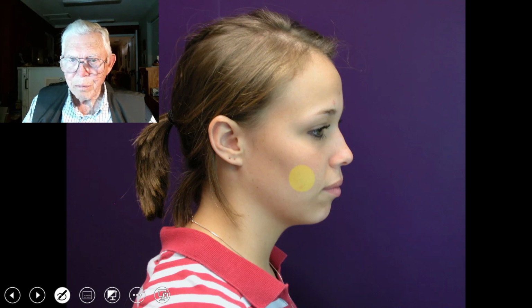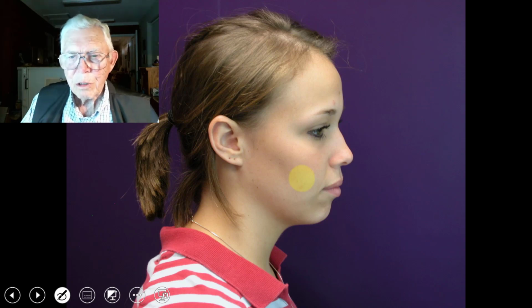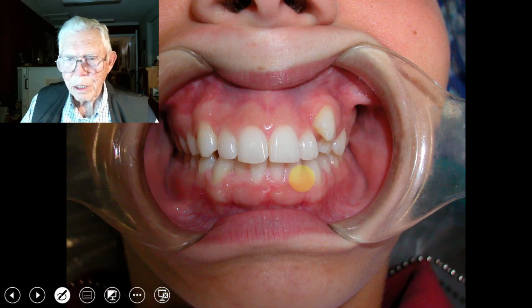And from the profile side shot here, the lips are out further than we would really like to treat a case, but I would never recommend taking out her bicuspids unless she actually wanted to.